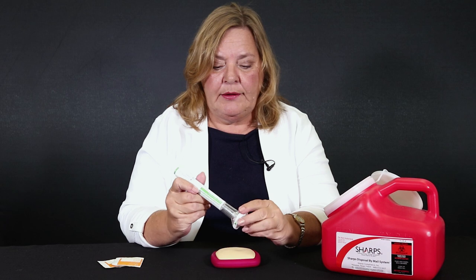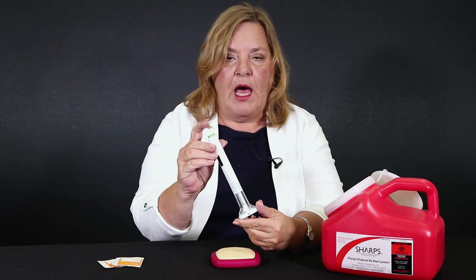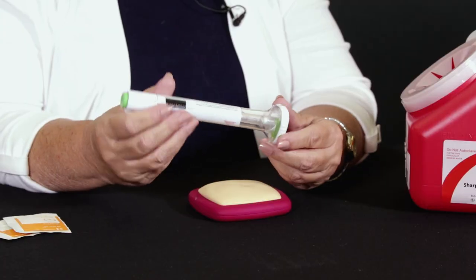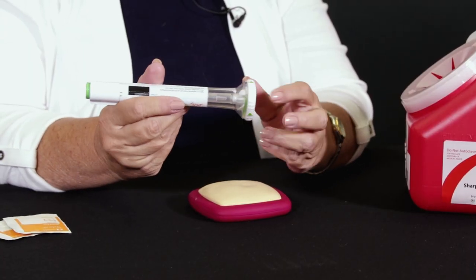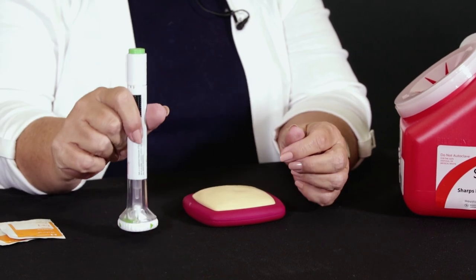Hi, today we're going to learn how to inject Taltz. Taltz comes in an auto pen and this is what it looks like. The top is the plunger and once we take this cap off, the actual injection will come from the bottom part here. So what you need to start with are alcohol wipes, your skin, and a sharps container.